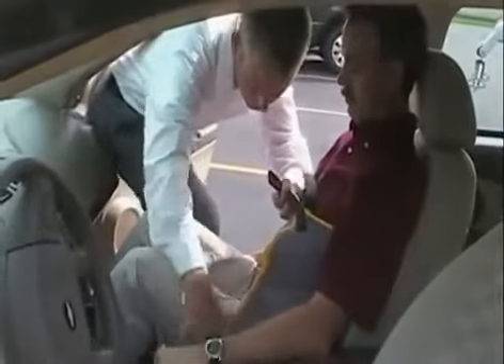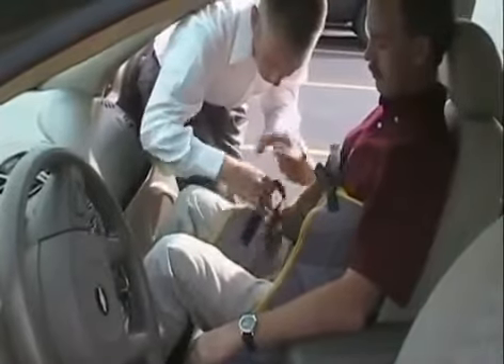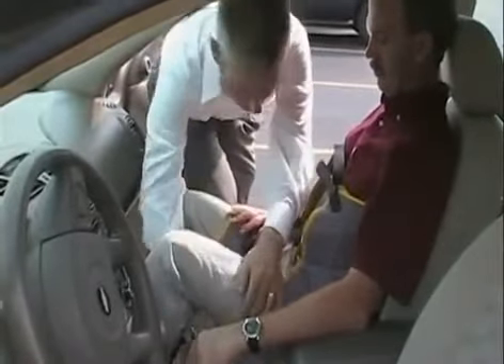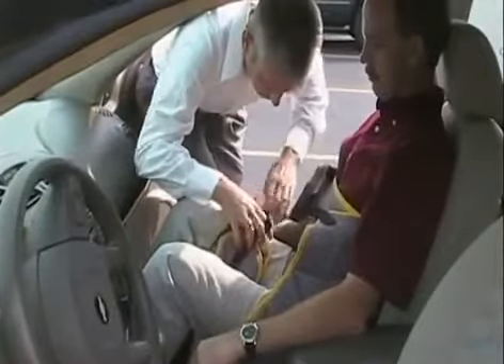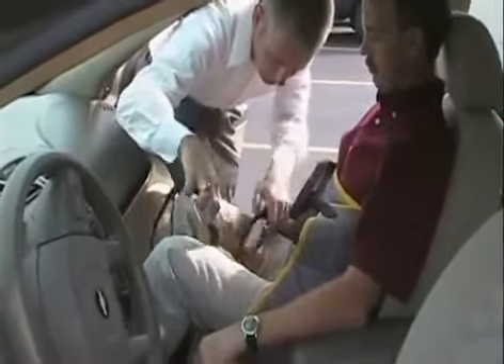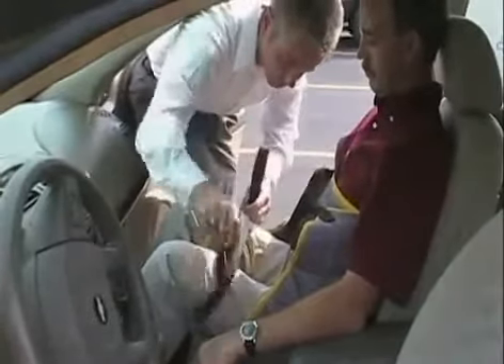Now I'm going to draw the leg straps down, and I'm actually going to put one leg strap under each leg. Right side — and if you can put your hand there for me, that would be great. Left side — and after I've got both in place, I'm going to move that in. I'm actually going to cross these, and simply take one and feed it through the other one so that they're crossed.